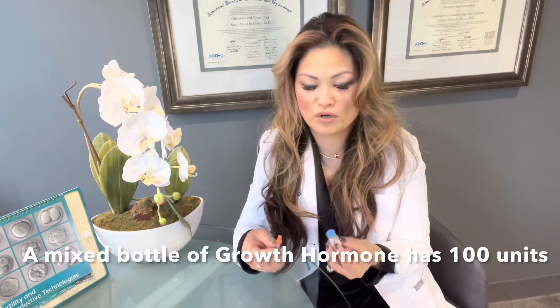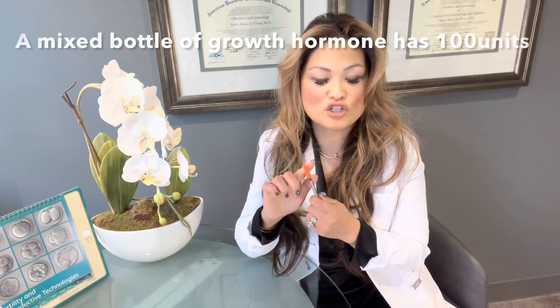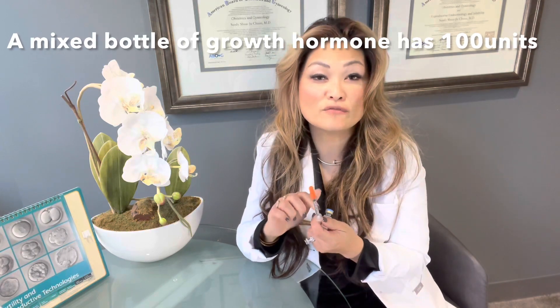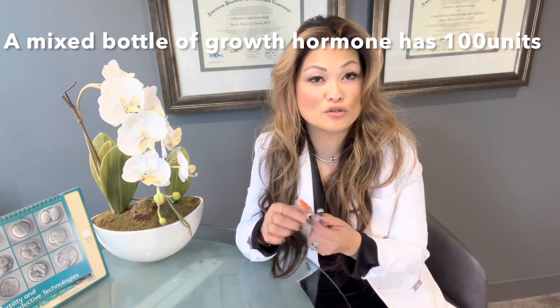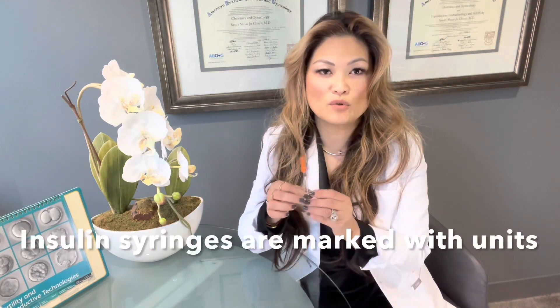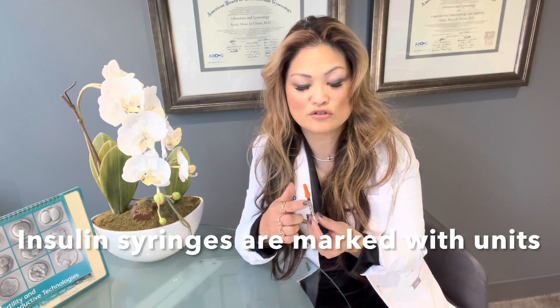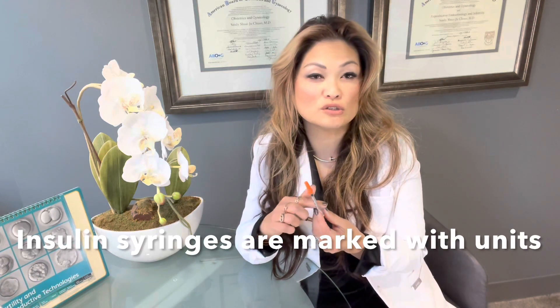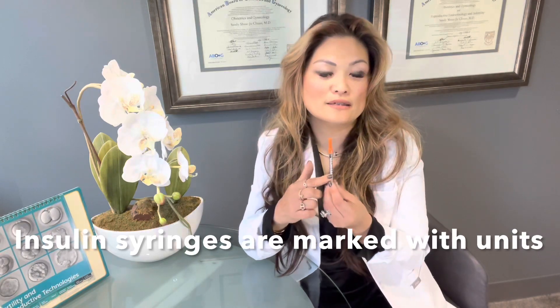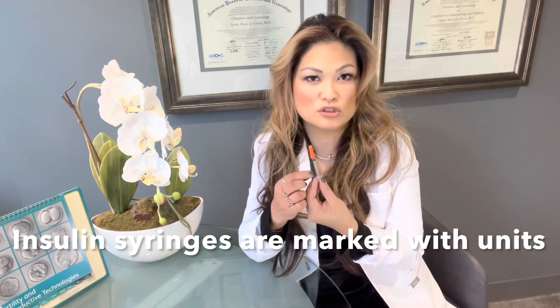Once you have that growth hormone ready, get out your insulin syringe. Usually insulin syringes are orange-capped and come in two forms — one with 50 units, and sometimes a bigger needle that has 100 units. Both of them will be marked clearly on the side with units. There are two types of markings: one is for units and the other is for ml. You will want to find the side that is marking units — it'll actually say at the very bottom 'units.'